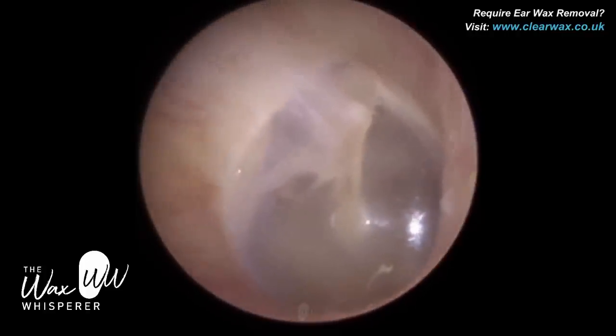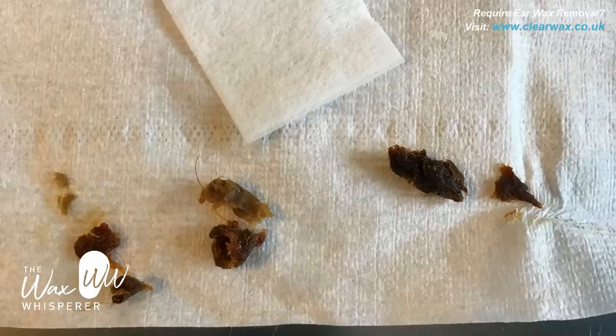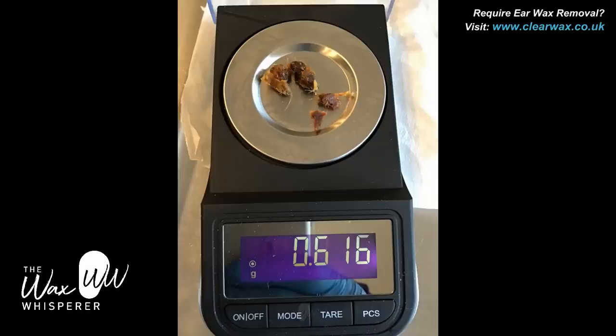There's the patient's ear canal, there's the eardrum — healthy, but slightly retracted. You can see the chorda tympani there. There are the remnants of the patient's ear. You can see some of the plugs of wax are darker than the others. The darker plugs are the ones that have been in the ear longer — they've oxidized, a bit like an apple or an avocado when cut and exposed to oxygen; it just turns a darker brown, almost blackish color.